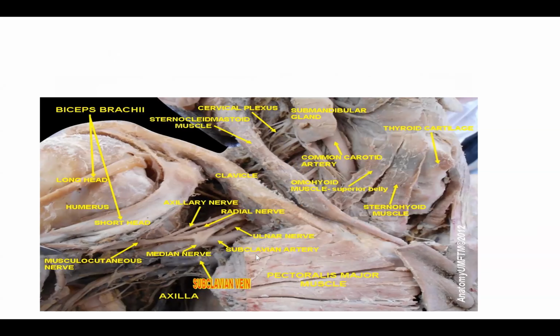So looking at the vein, you can see there are so many things in this diagram, but what I want us to bring up here is that the clavicle is here. You can see my cursor around the clavicle, purely labeled here. Then you can see the vein and the artery just posterior to it, and the vein a little bit bigger than the artery. So these are things that form your choice of anatomy. I will still describe, when you are talking about the landmark, the medial third. So get closer to the clavicle and the way you should go to do your various punctures.